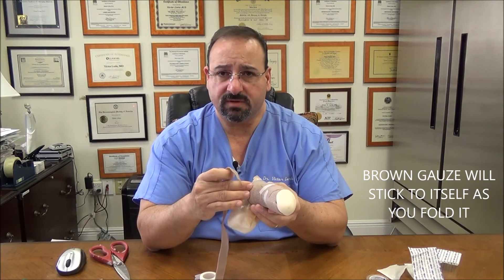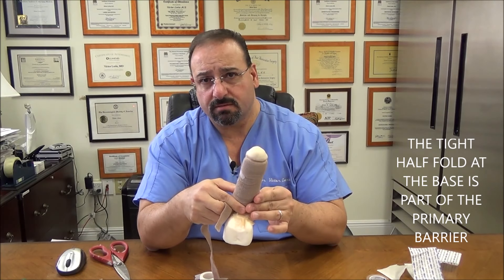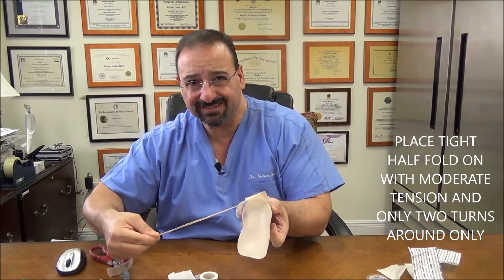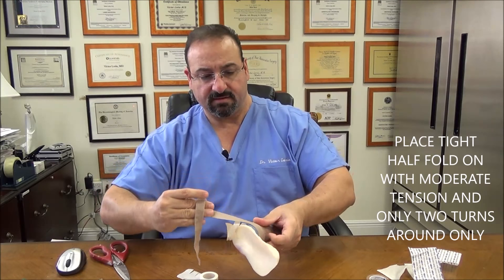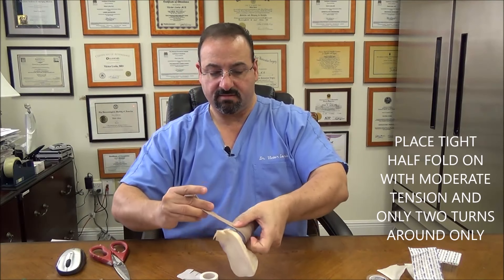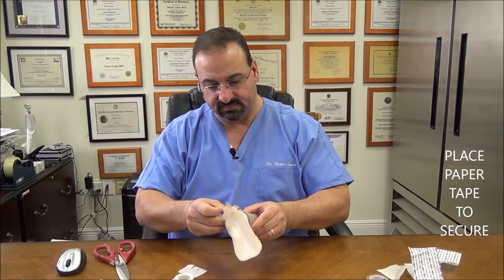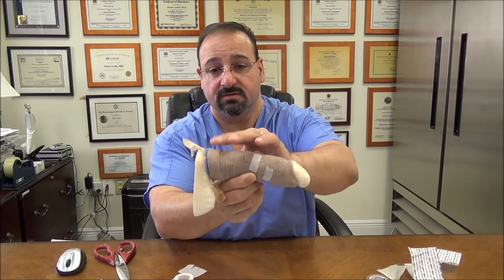The half fold at the base is very important — it's part of your tight constrictive area, we call it a barrier. It's part of your barrier mechanism. We're going to put this on, leaving the blue edge visible, and go around with moderate tension — not too tight. Go around twice with moderate tension. Cut the extra off and put a piece of tape to hold it in place. This is the tight half fold because it's part of your barrier at the base.